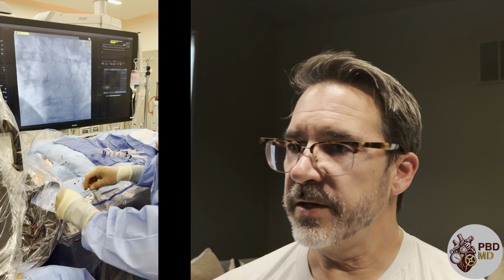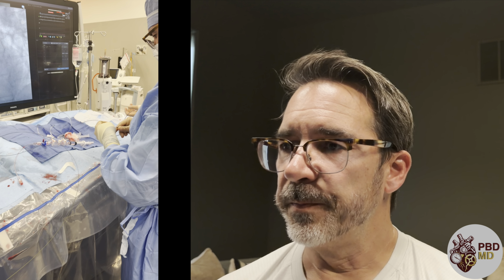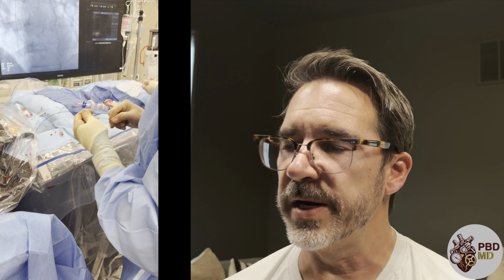In this particular case, fortunately, the test was essentially normal blood flow, so that little bit of restenosis isn't causing any trouble at all. Hopefully that will continue to be the case in the future. So now we've looked at the right coronary artery, we're now going to look at the left coronary artery.